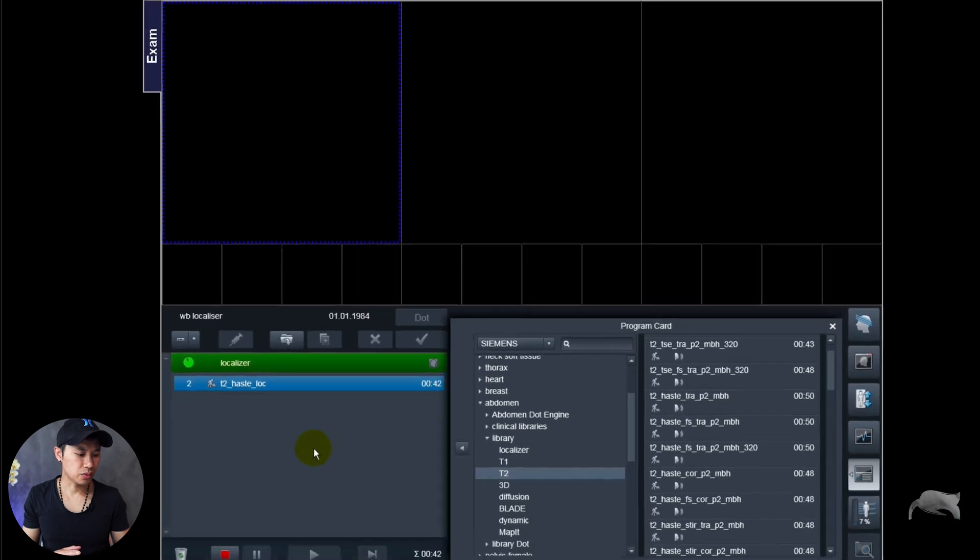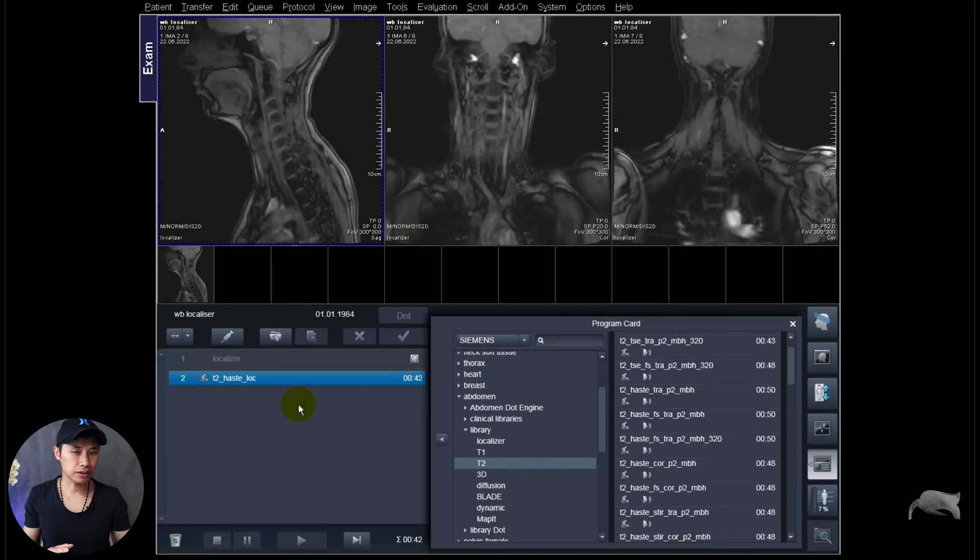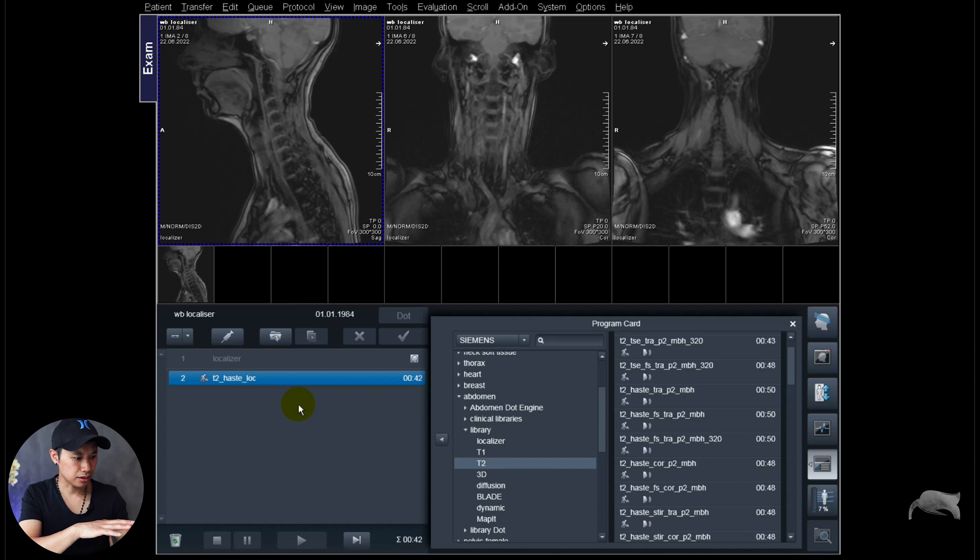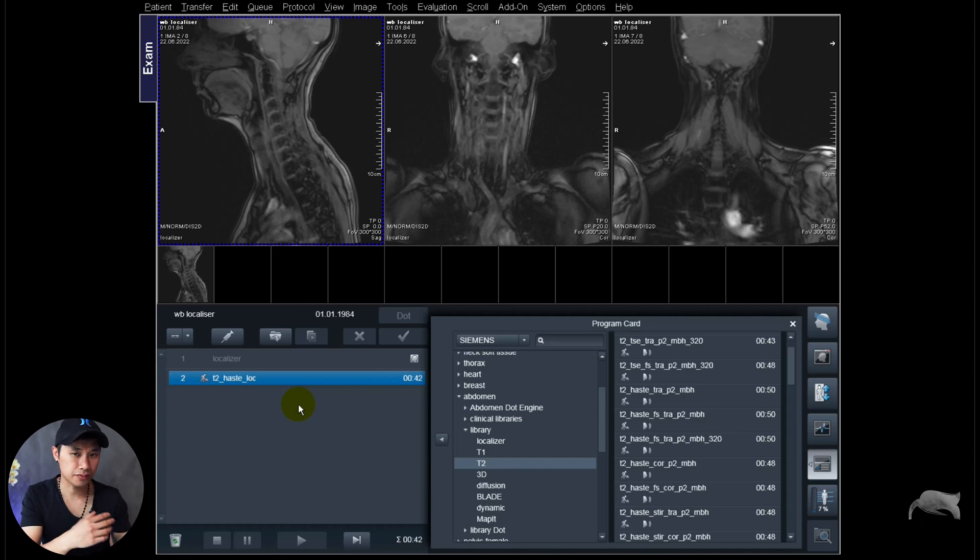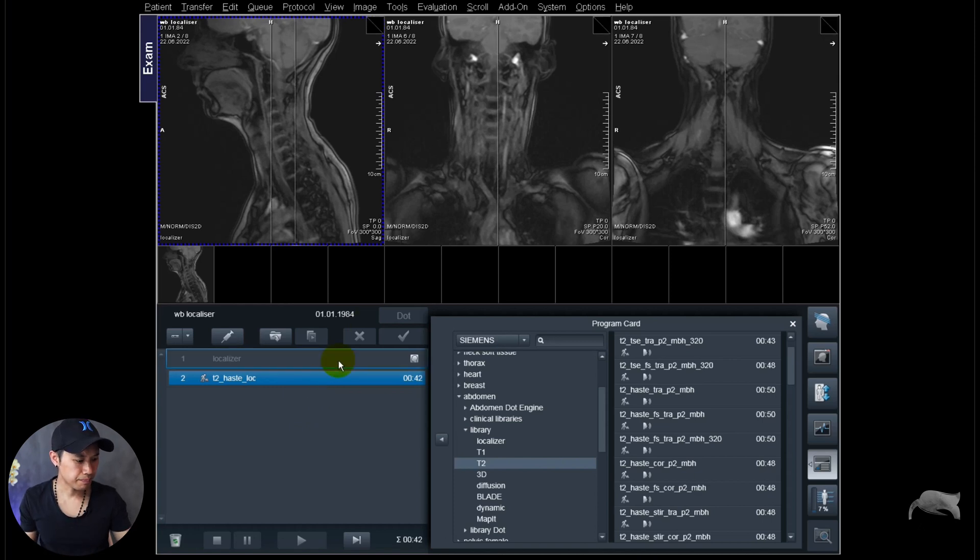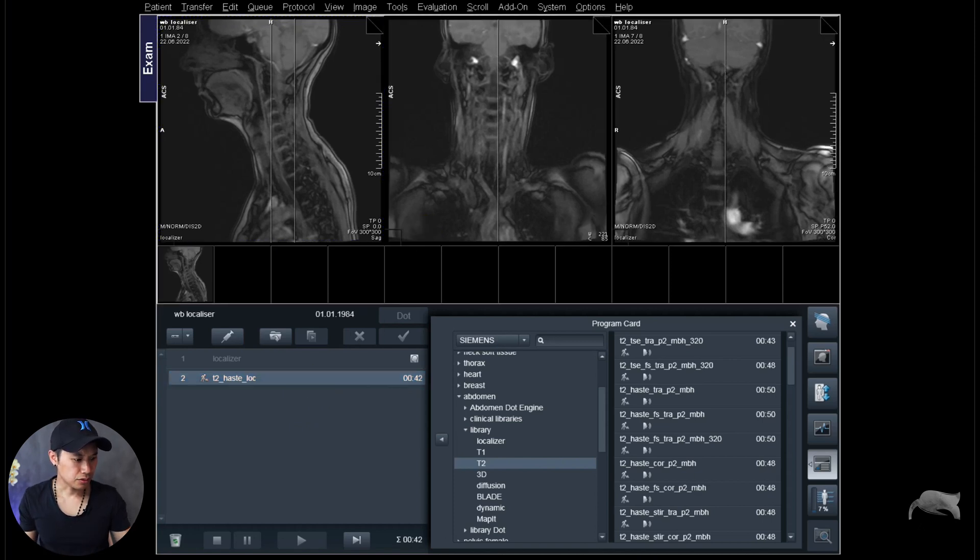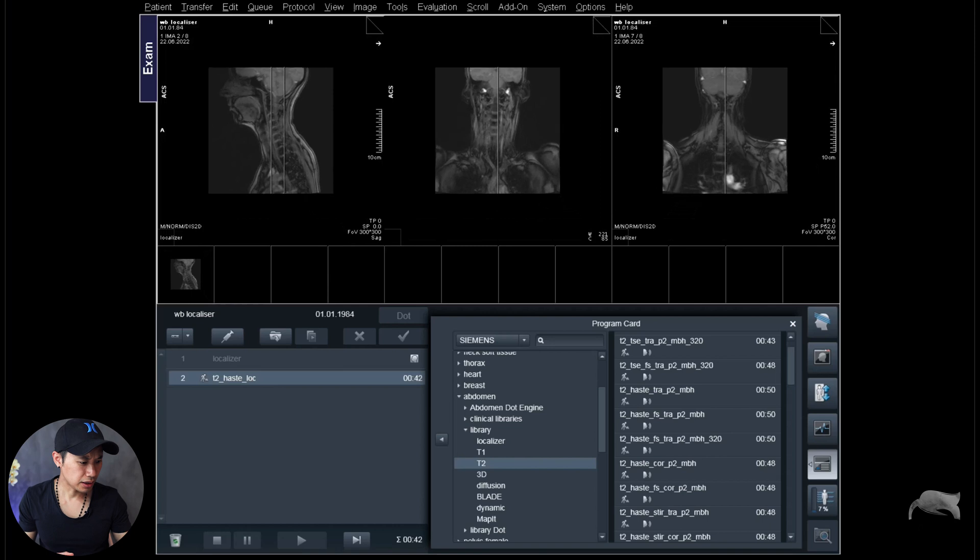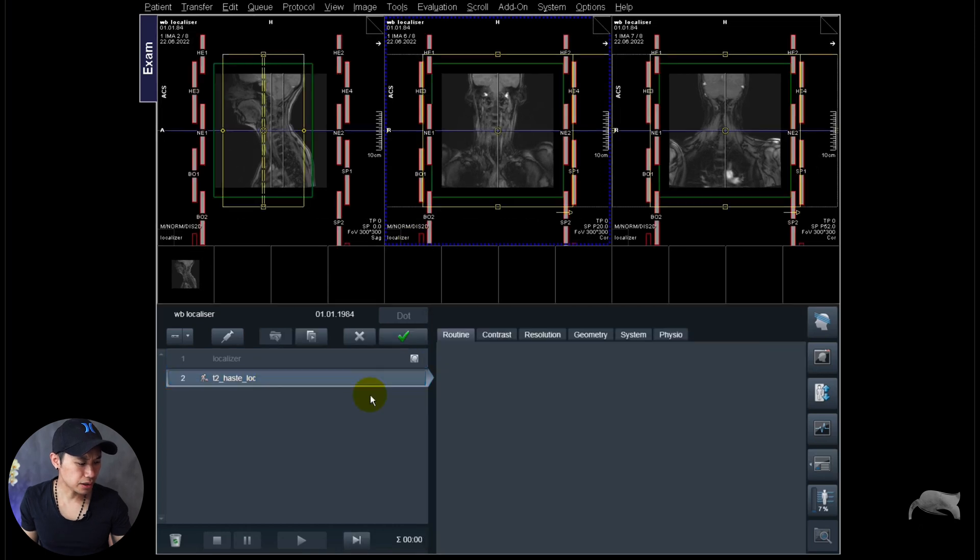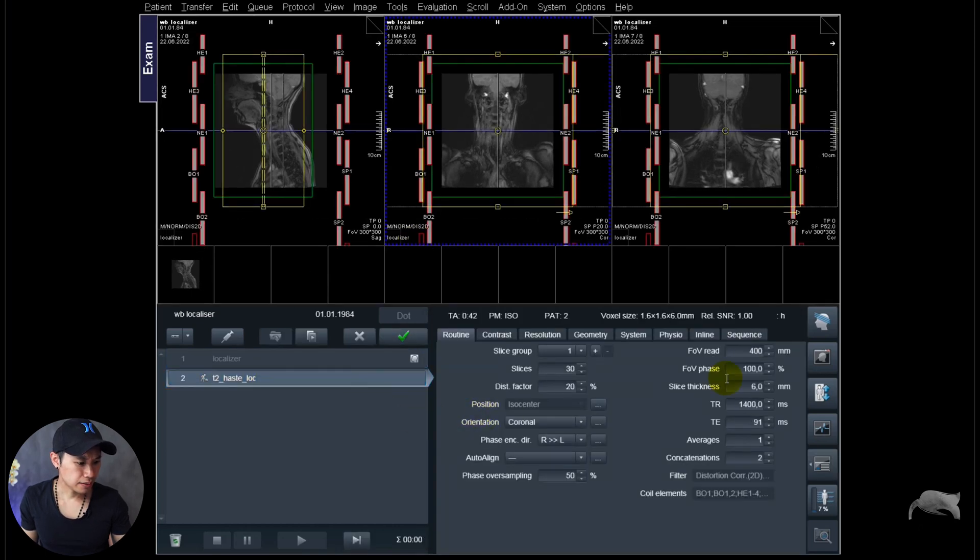Whatever you do, right click, go to voice commands and just turn no voice and then okay, it will disappear because we want it to run free breathing and run automatically. So this is a flash-based localizer from the cervical spine. I just want to have this as overview so I can show you the basics of everything. So just zoom out a little bit here so we can open this one.